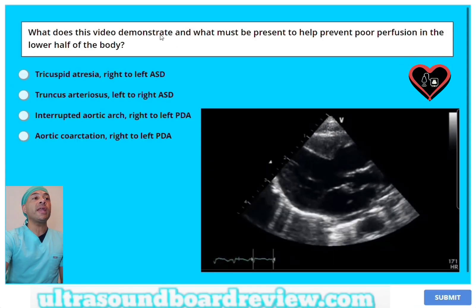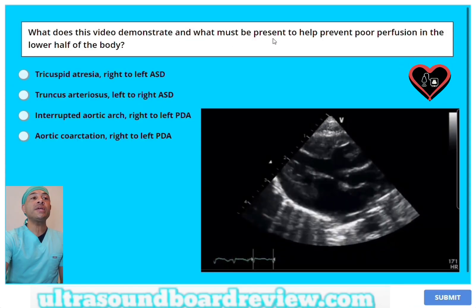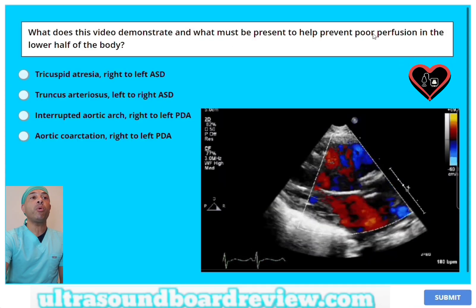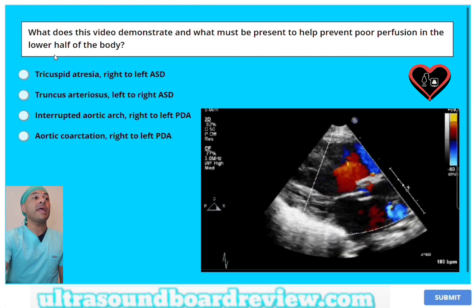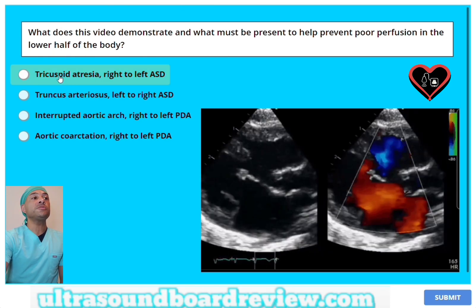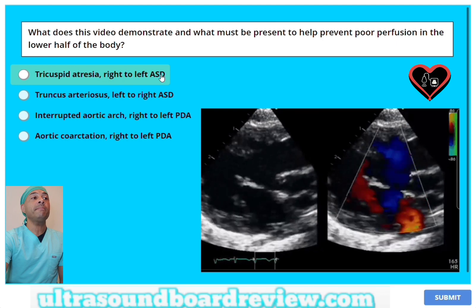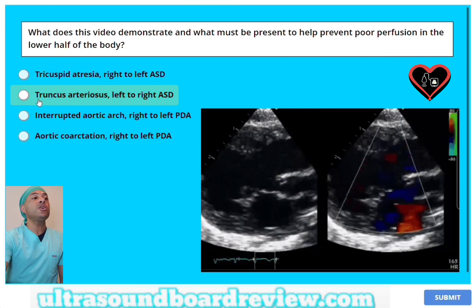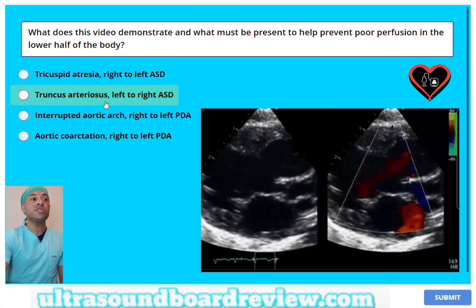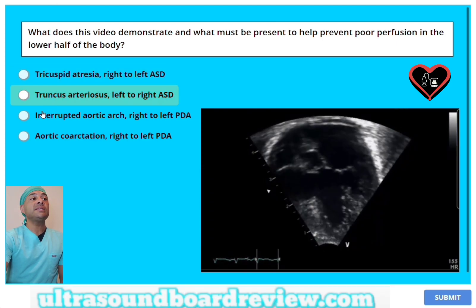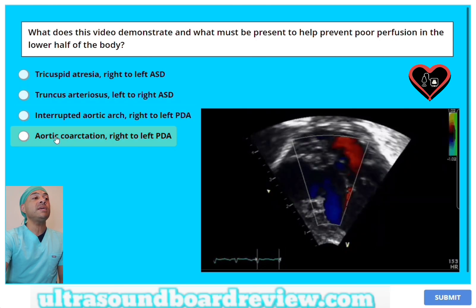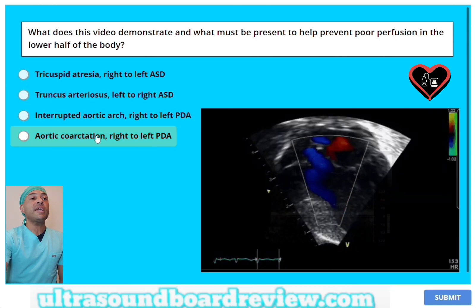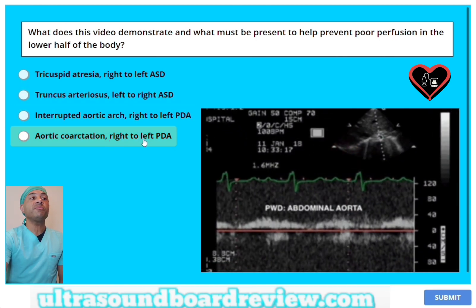What does this video demonstrate, and what must be present to help prevent poor perfusion in the lower half of the body? Is it A, tricuspid atresia and a right-to-left ASD? B, truncus arteriosus and a left-to-right ASD? C, interrupted aortic arch and a right-to-left PDA? Or is it D, aortic coarctation and a right-to-left PDA?